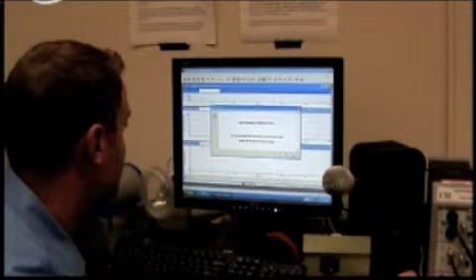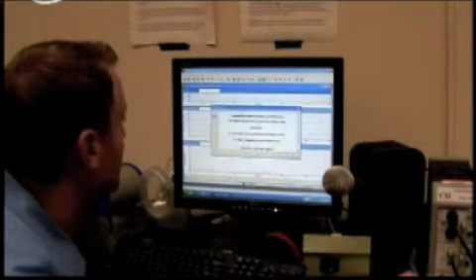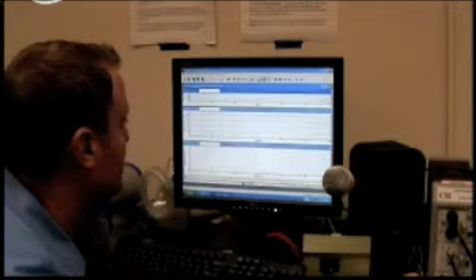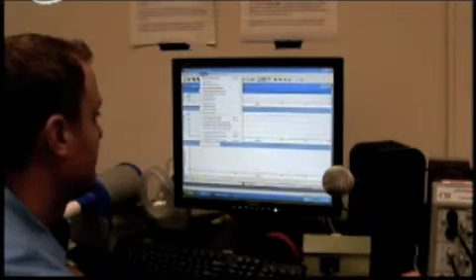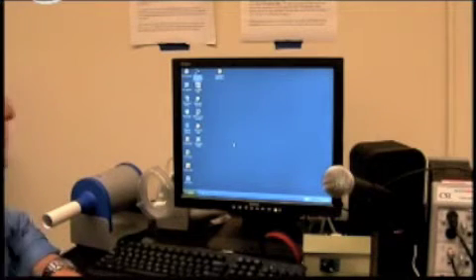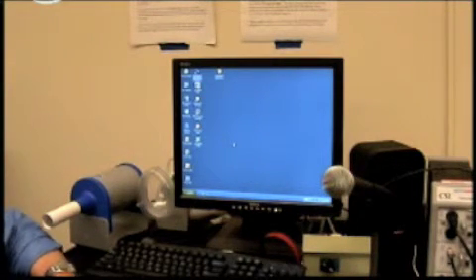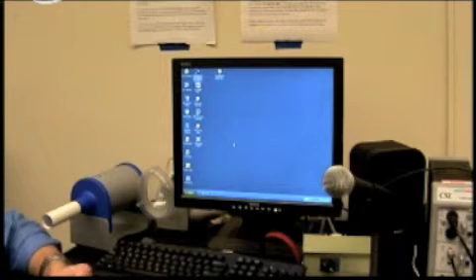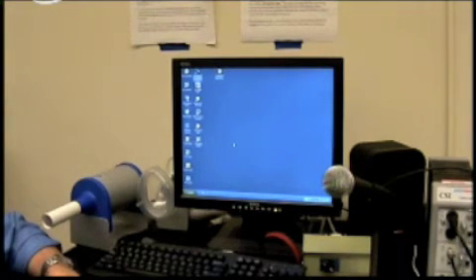Let's see what this one looks like — oh, this is pitch, sound pressure, and air flow. Once you get comfortable with user-defined protocols, you can just say you want to do that. Flow, I find useful for people with vocal fold paralysis, vocal nodules, that sort of thing — in which maybe there's high or low airflow. Somebody who's hyperfunctional or has spasmodic dysphonia has low airflow values, for example. That's it.